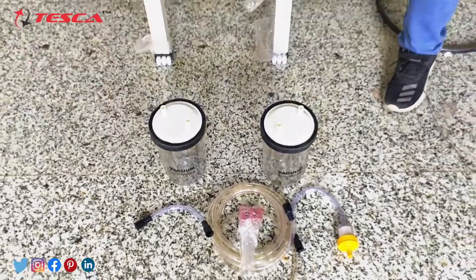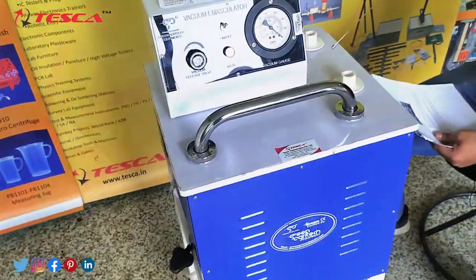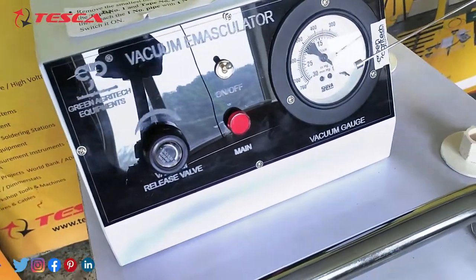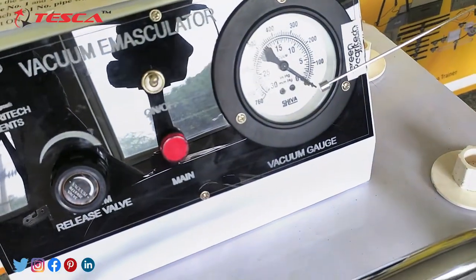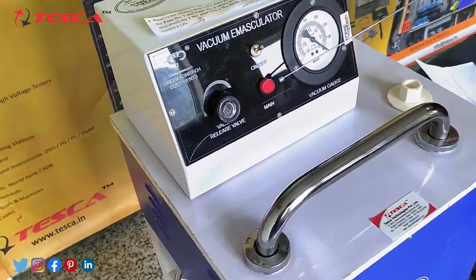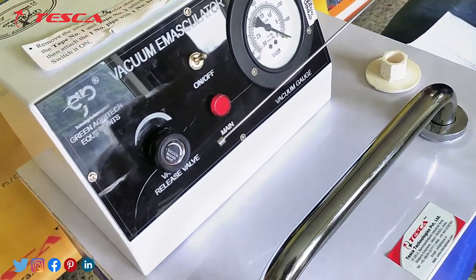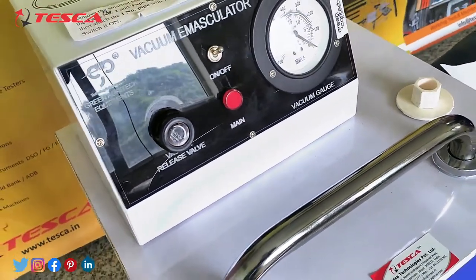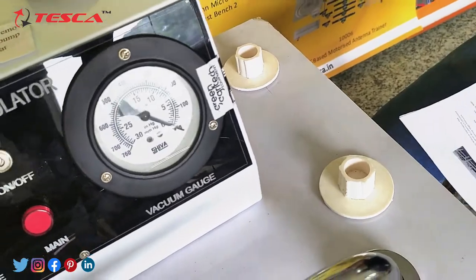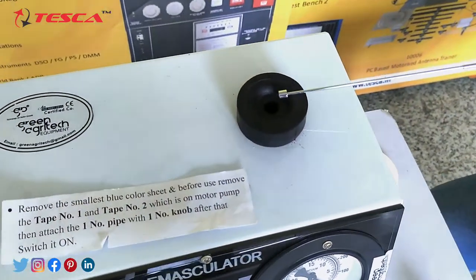Now let us discuss the front panel controls in detail. This is the vacuum gauge, which can read up to 760 mm Hg for vacuum reading, and 30 inch Hg in the vacuum section. We have the main indicator, an on/off switch to turn on and off the vacuum motor, and a pressure relief valve for setting up the required pressure for the spikelet. These are the stands for placing the autoclaveable jar, and this is the suction pressure inlet point by which we can connect the filter and start sucking using the vacuum emasculator.